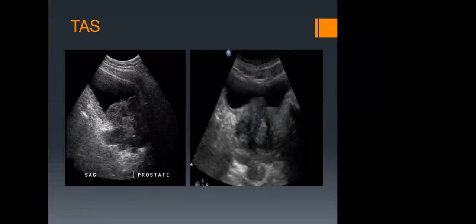Now, why I say this is rare, in this image here, you can see the lesions are very many, but why we are discouraging transabdominal, you will get a normal prostate with a lesion as big as only 3 to 4 millimeters. These lesions are more than 3 to 4 millimeters, but even a lesion of 2 millimeters has malignancy and is something to worry about. If you don't pay attention to it, sooner or later, you are paying for the consequences. So transabdominal cannot show you lesions less than 4 millimeters or less than 3. That is why we are discouraging transabdominal.